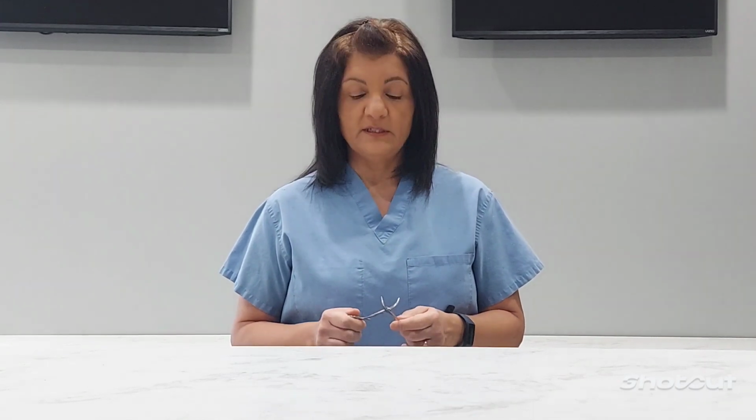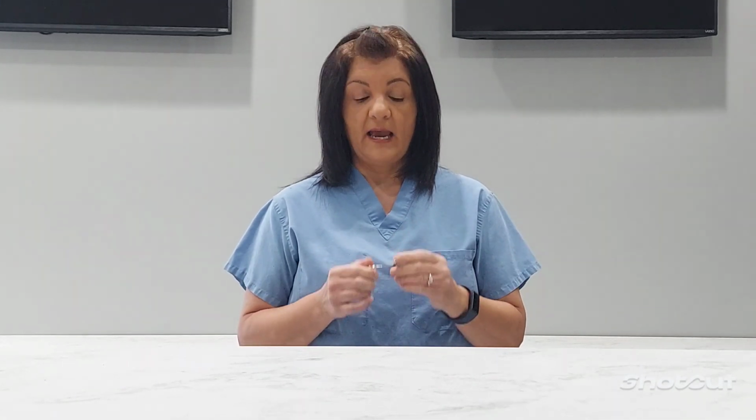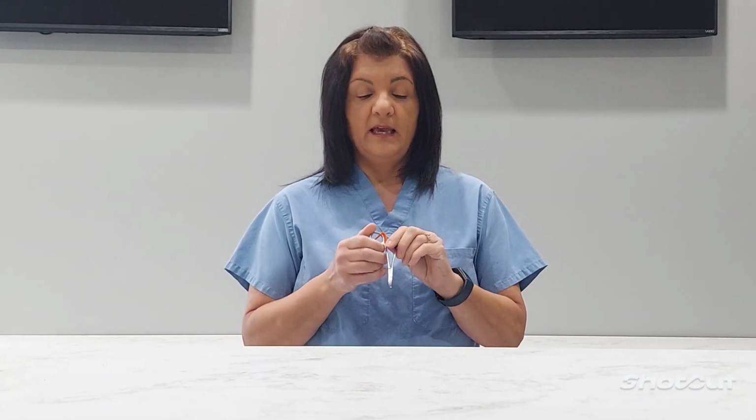This is Carol Malone, and today we're going to talk about instrument inspection. The first item we're going to look at is a simple hemostat. This is a curved hemostat, and the inspection points are the lock box. We're looking for pits, cracks, rust, and stains.